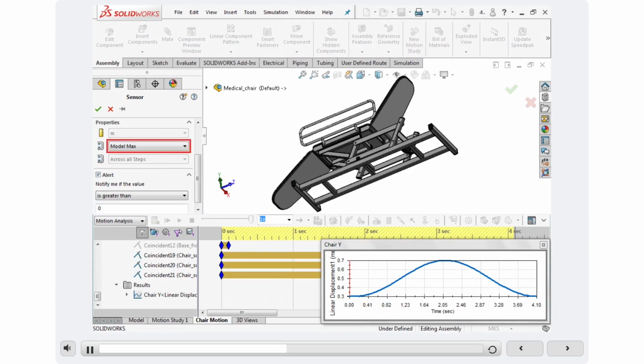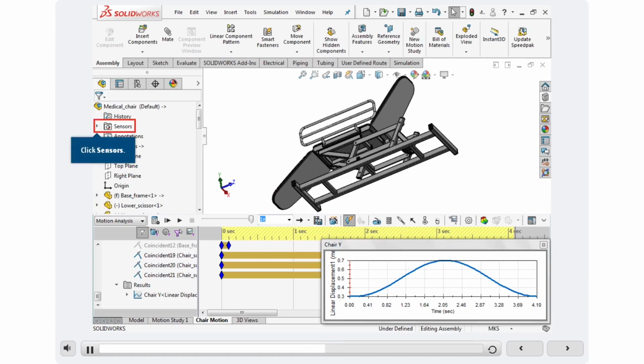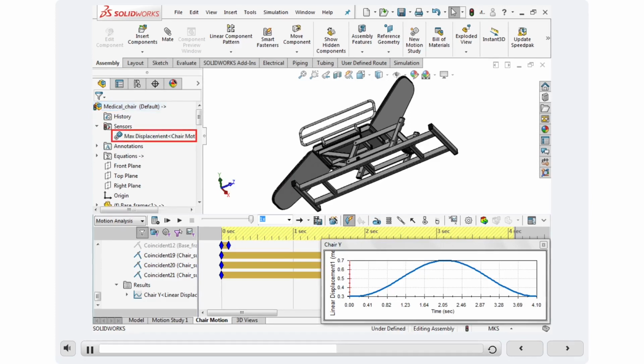Under Properties, make sure that the criterion is set to Model Max. Alert notifies the user when the sensor value deviates from the specified limits. We will clear this box, otherwise a violated constraint would be displayed automatically in the optimization study. Clear Alert. Click OK. Expand the Sensor folder in the SolidWorks Feature Manager. The Sensor 1 has been renamed as Max Displacement.